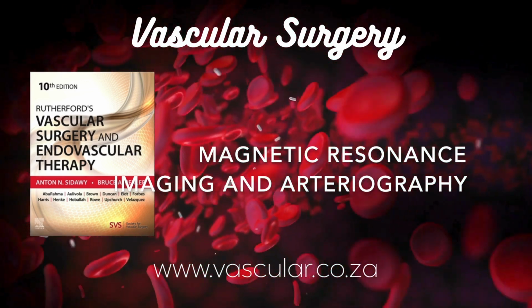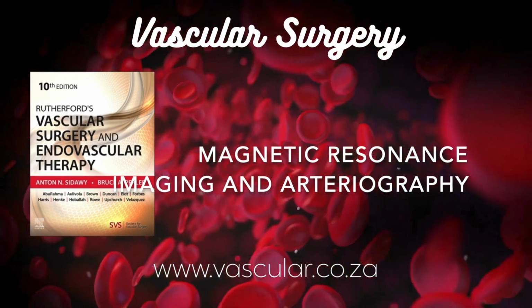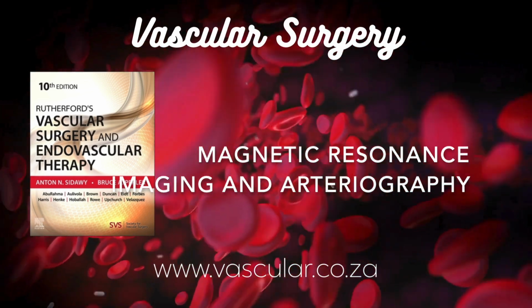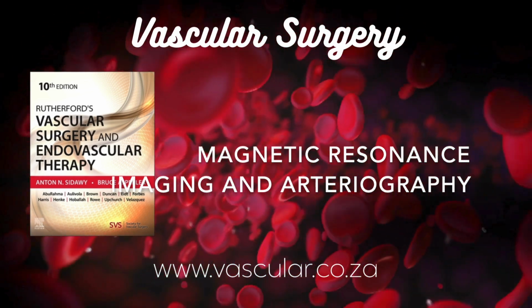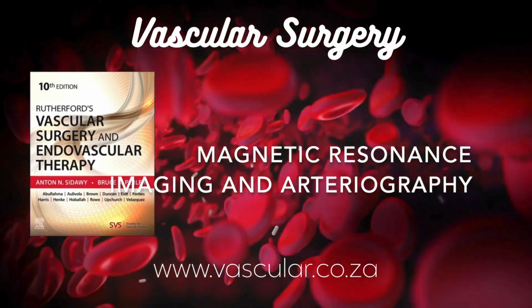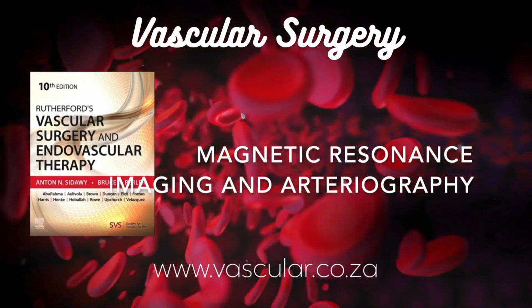Accessory arteries. Why is that important? It's super important if someone is being evaluated as a living kidney donor. The surgeon needs to know exactly how many arteries supply the kidney they're planning to take. MRA helps avoid surprises. And it reduces the need for invasive angiograms. Often, yes. Good MRA can provide the roadmap for treatment, reducing contrast exposure and procedure time.